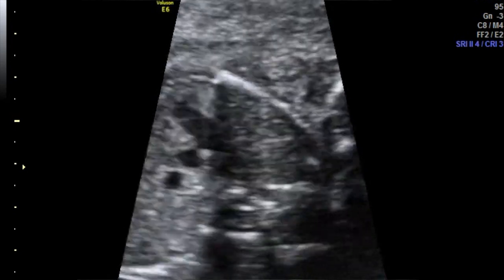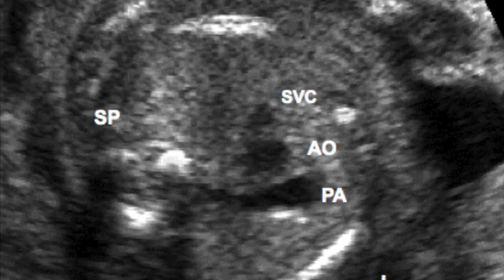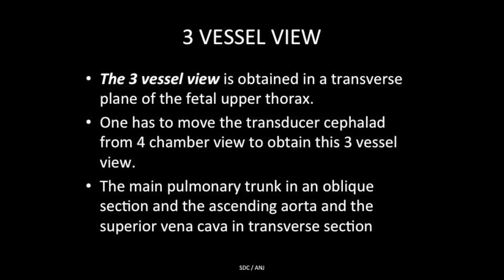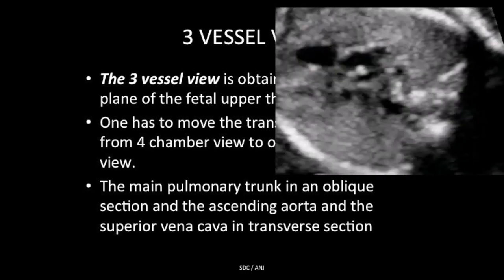In this view, the main pulmonary trunk appears in an oblique section, while the ascending aorta and the superior vena cava are seen in a transverse section. Starting from the upper thorax, with the right side, spine, and left side oriented, moving from right to left: the smaller circle is the SVC, then the aorta which is a relatively bigger circle compared to the SVC, and then a comma-shaped structure which is the pulmonary artery. Moving a little more cranial gives the three vessel trachea view.